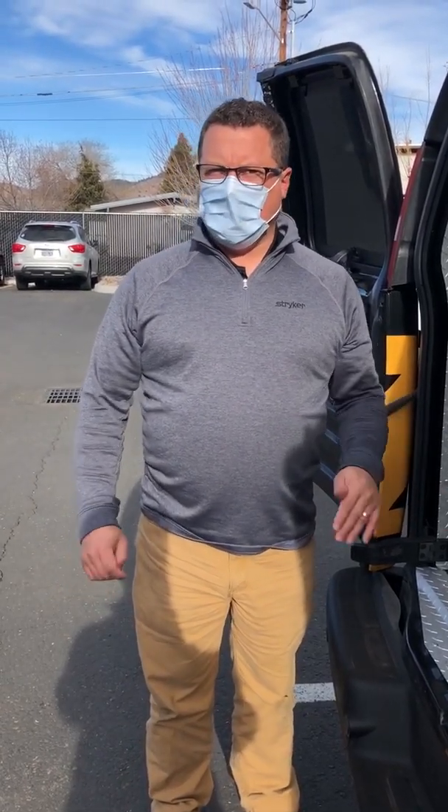Ben with Stryker here to talk about your new power loading systems for your ambulances. What I'd like you to do most is play with them powered. 98% of the time they're going to work very well and that's how you're going to interact with them. So that's what I'd like you to perfect first before then going into any troubleshooting scenarios.